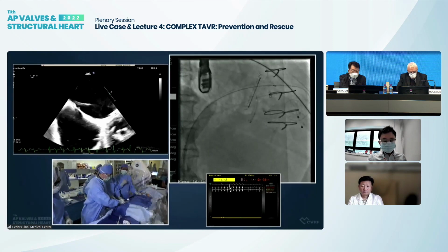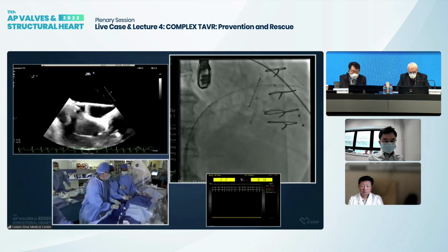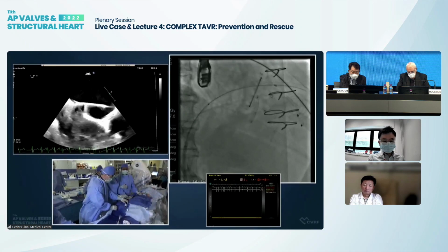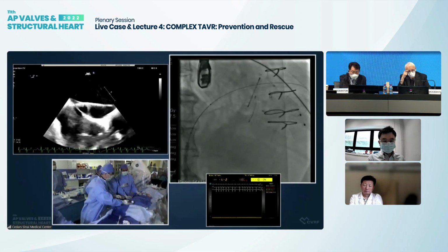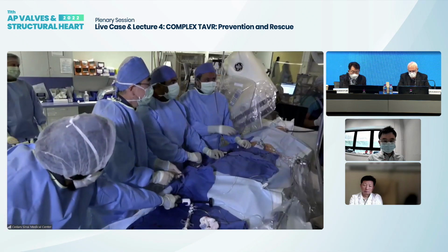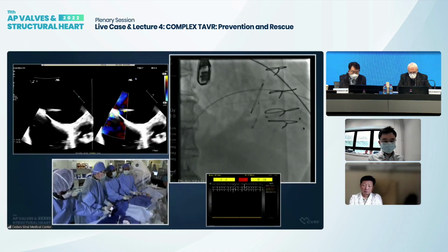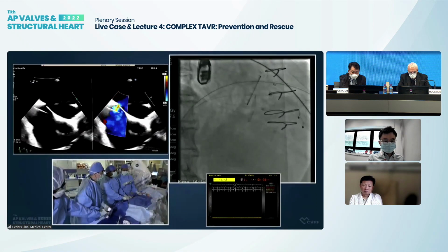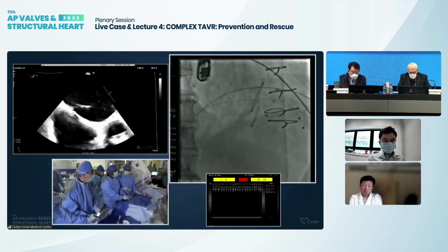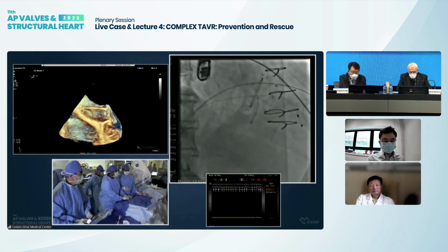Okay, so the other thing to remember is that a lot of surgeons, when they do mitral valve replacements and tricuspid and all those things, will repair the septum and fortify the septum somehow, because they go transeptally and they'll put patches, and that becomes a challenge at times. So one of the first things on your checklist, when you're prepping these patients or working these patients up, is to look at their septum and see whether that has been done, because then you're prepared for the extra time and effort that may be needed. In this case, that wasn't the case.